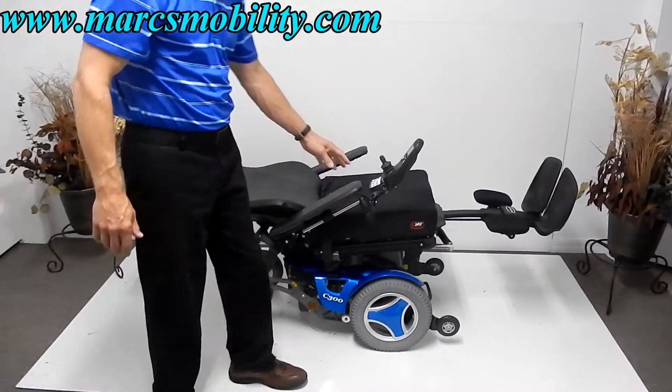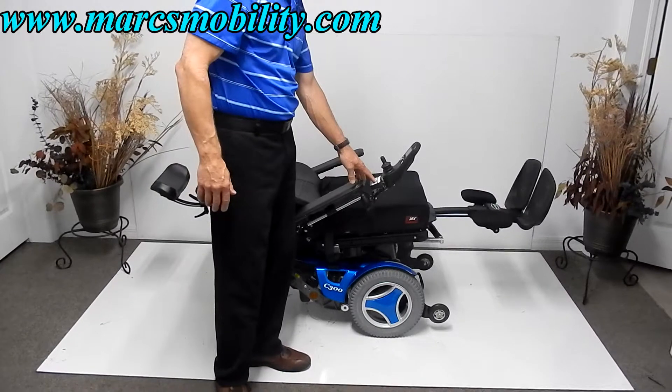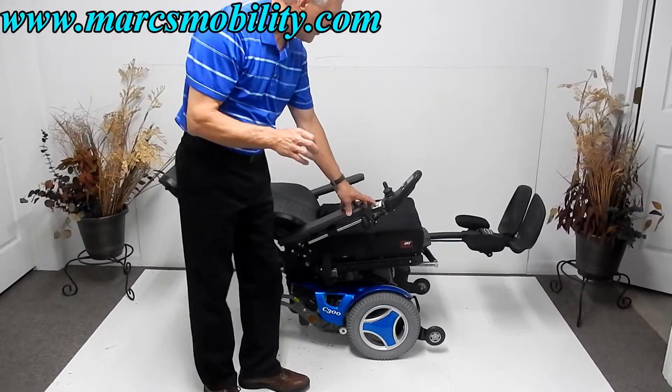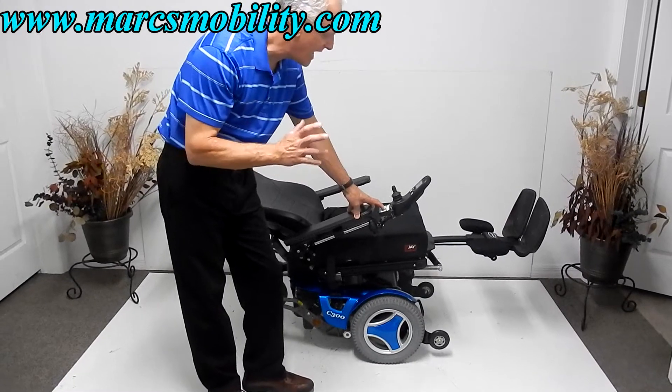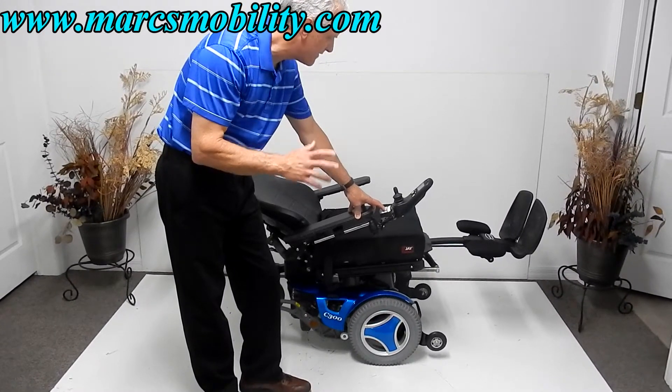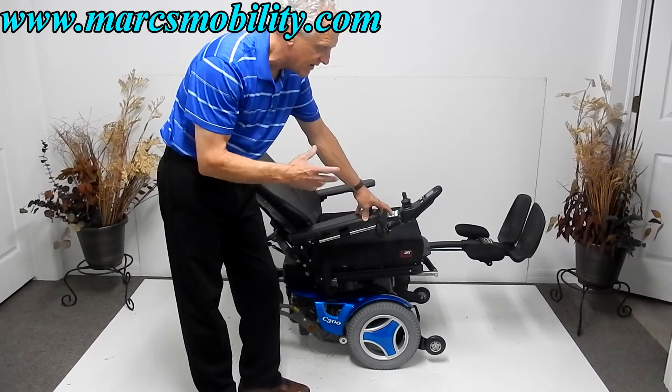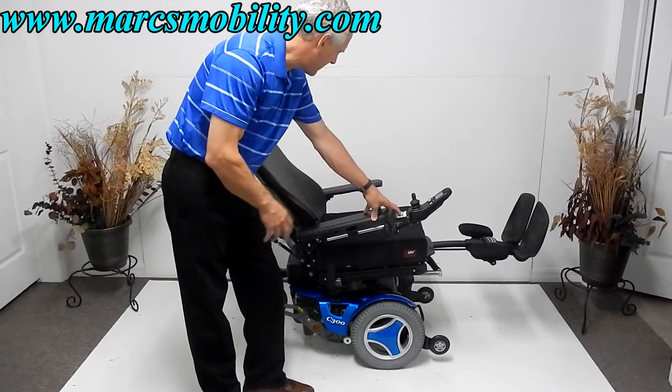So you have electric recline, electric tilt, electric legs, and an 8-inch seat lift — Permobil quality. Permobil is the highest quality chair you can buy in the U.S. It's a Swedish-made chair sold here in the U.S. and many other countries, and it's the highest quality power chair you can get.